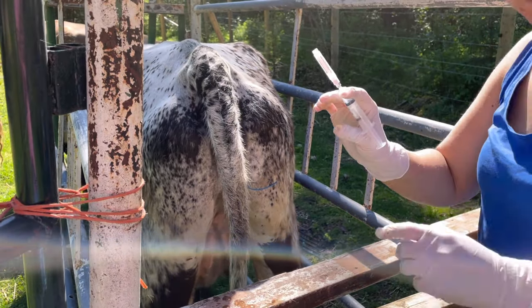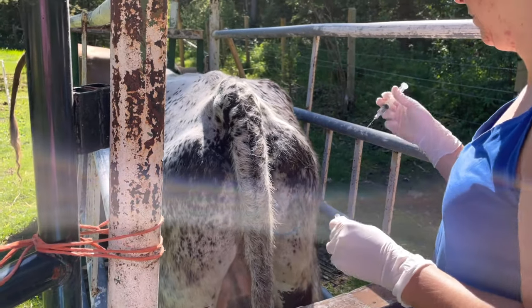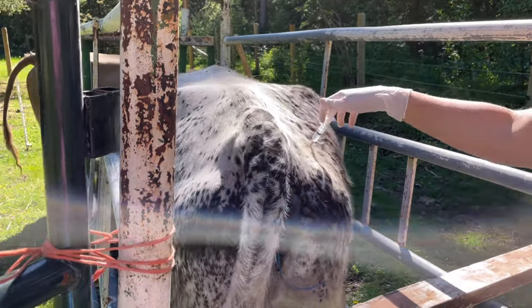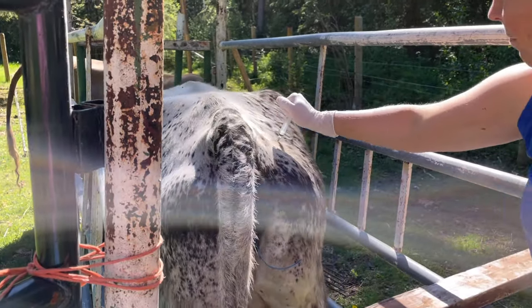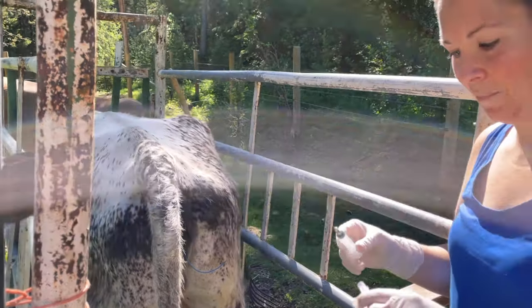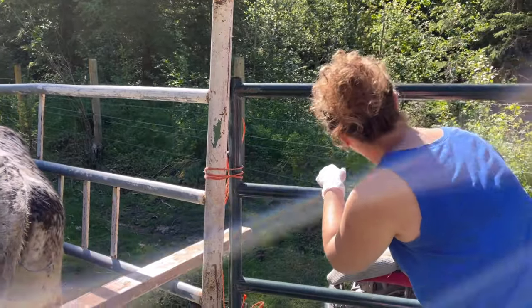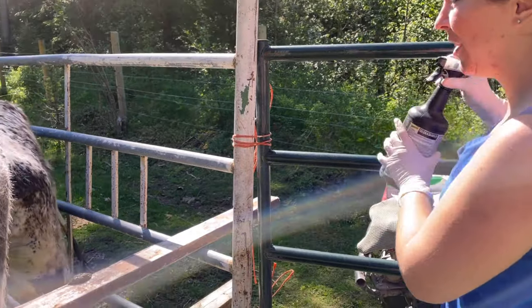You're going to lift the tail and push until the tail is sticking about up, and release the device. Ejection — and we're done. I'm also going to spray her for flies since I have her in here.